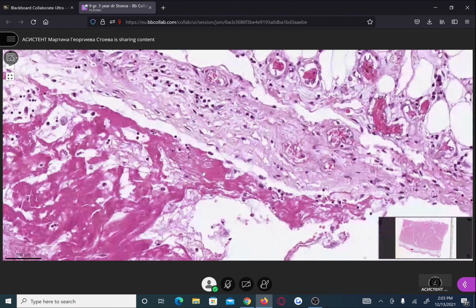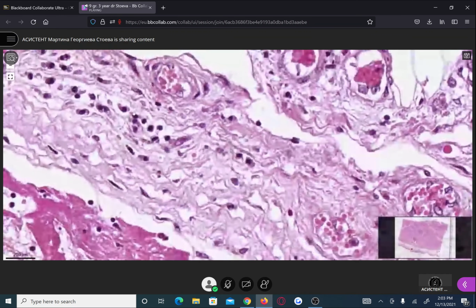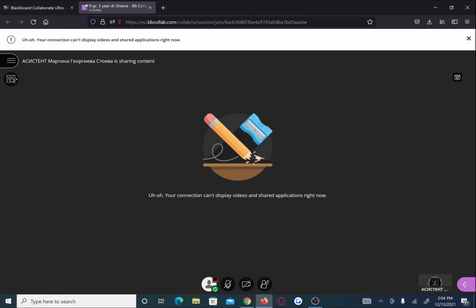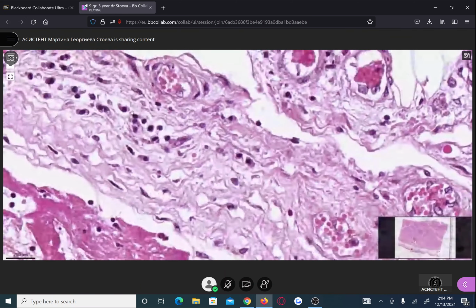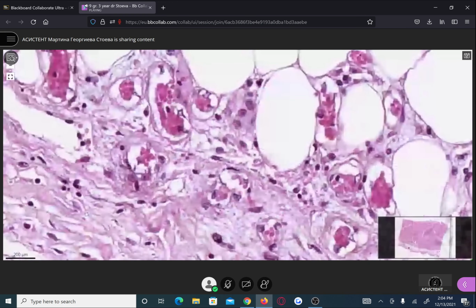Some of the inflammatory cells are neutrophils. Unfortunately, honestly, in this slide we can find mainly mononuclear cells. You know that fibrinous inflammation is an example of acute inflammation. It's a type of acute inflammation. So usually in between the fibrin strands, we expect to see neutrophils. But here, I would confirm that most of the cells are mononuclear, but not neutrophils. Here and there we can find some neutrophils, but they are not as many as they should be.